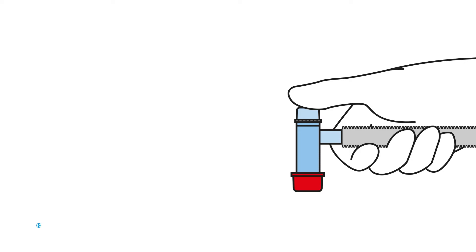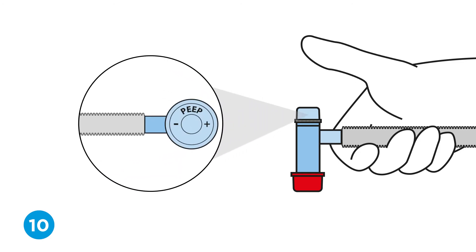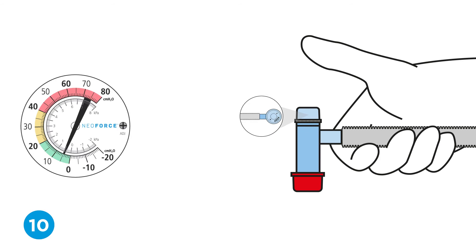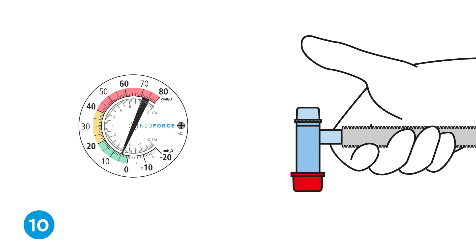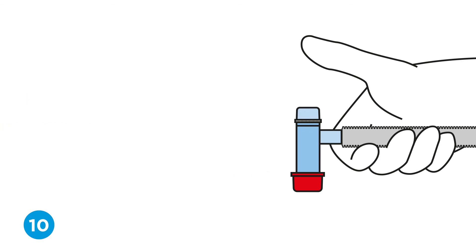Step ten, set the PEEP. Stop occluding the PEEP valve cap while continuing to occlude the T-piece outlet using the red cap. Adjust and set the desired PEEP level by turning the T-piece cap and verify settings on the pressure gauge.